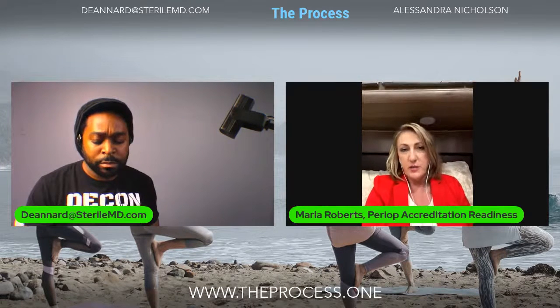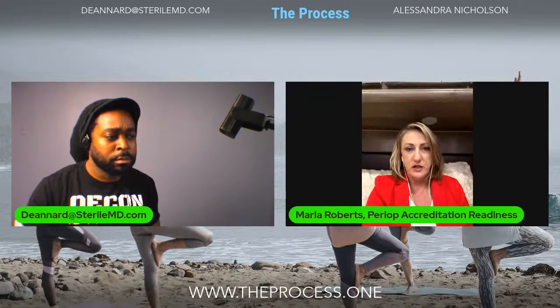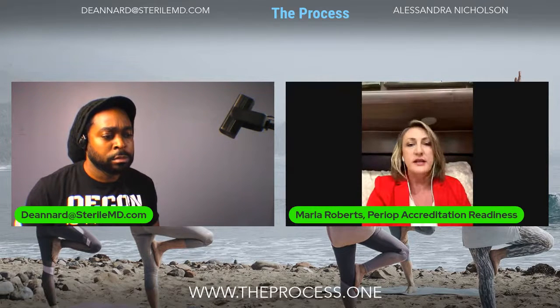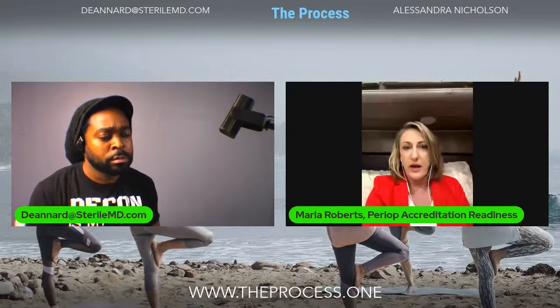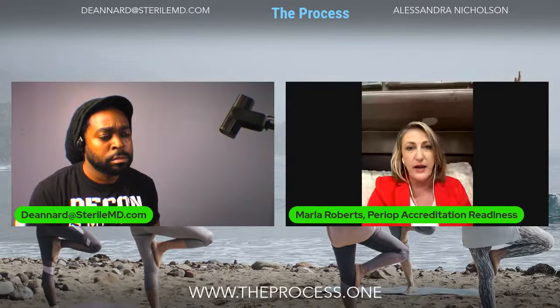If you're in endoscopy and you have a Medivator, suppose your Medivators go down or your hospital gets a better deal with Olympus and you're remodeling, so you decide to go to Olympus. When that happens, all of those policies have to be changed. So you should say an automated endoscopic reprocessor, AER, instead of the name of it. That's the answer to one of your questions: list what type it is, but not the brand name of it.